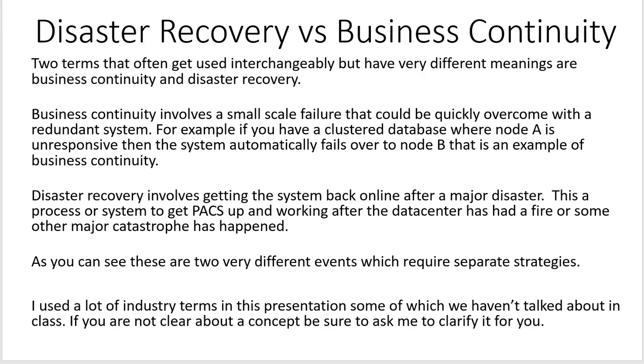So, disaster recovery, right? There's a fire at the data center. The entire PACS system has been burned to a crisp. You've got to get it back up and running. Well, hopefully, you have a disaster recovery system that involves a copy of your database server, a couple of DICOM servers, an IMS, all those elements you would need to get your PACS back up and working in a different building, in a different city, in a different state. Maybe it's in the cloud, wherever you're keeping it. That's a disaster recovery system.